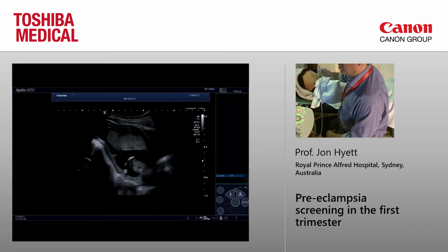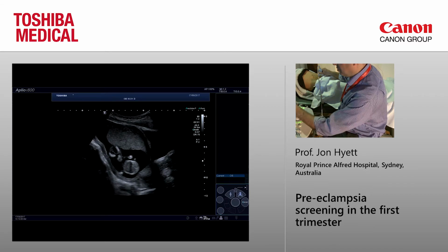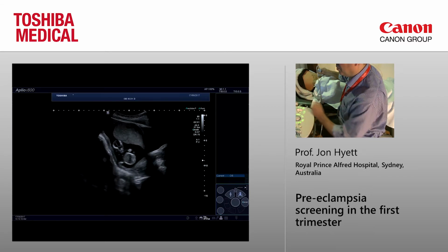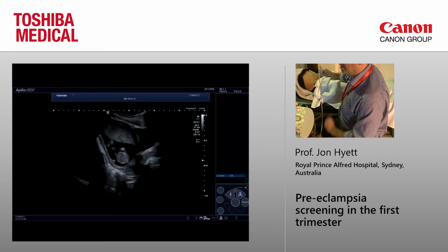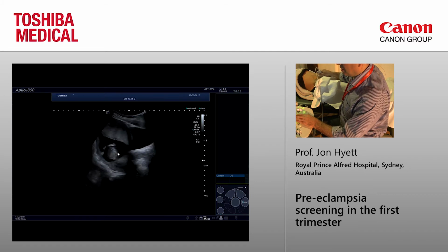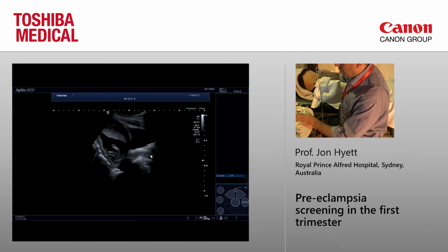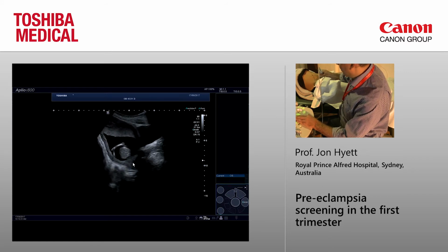So the first thing that I've done is take a more panoramic view, just to try to help make sure that I'm localizing anatomy properly. So you can see here that we've got the bladder on the right-hand side of the screen. Here, you've got obviously the uterus coming around. This is the placenta at the top. I've got our little fetus here, and then you can sort of see where the vagina's coming through, and then this is the level of the cervix in this area here.